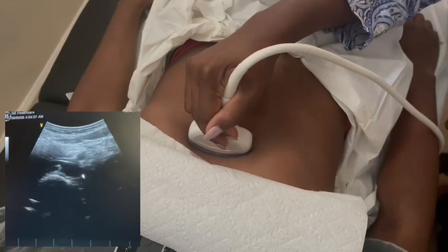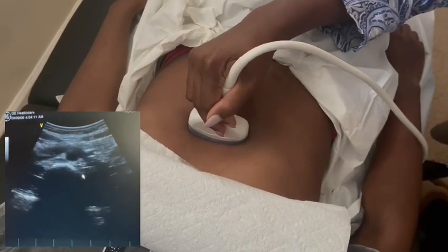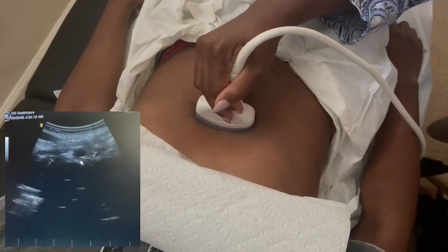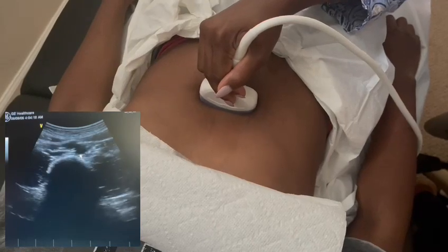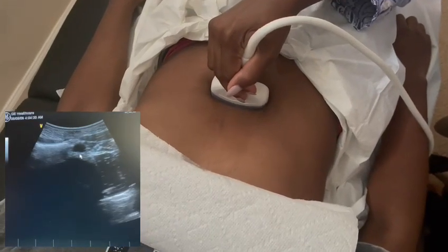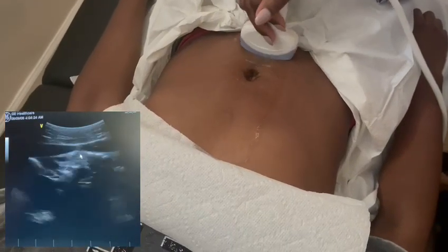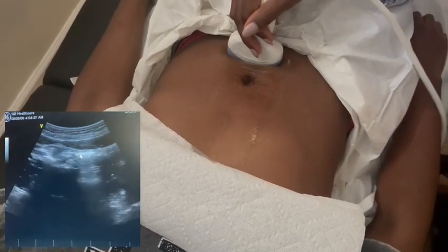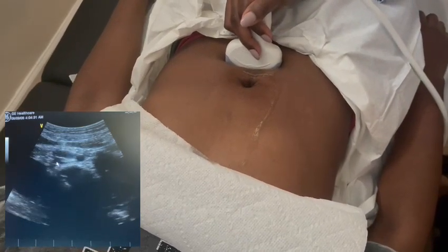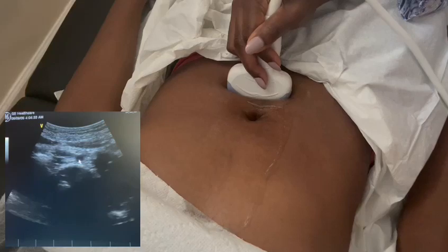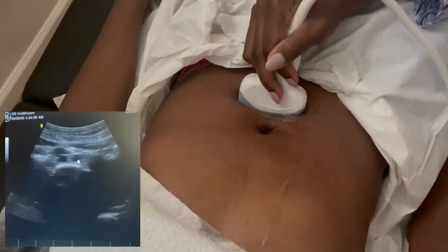You can breathe normally. That's your SMA. I'm going to follow that aorta all the way down to her belly button. When you're doing aorta imaging, you have to continuously adjust your gain. You can see the bifurcation right about there. The trick to the bifurcation I like to use is going below the belly button and angling towards her head. You can see the right iliac and the left common iliac coming, and you can see them become one as your distal aorta.